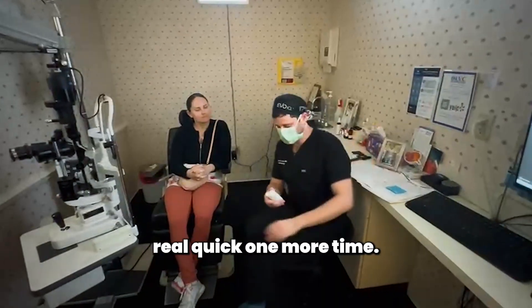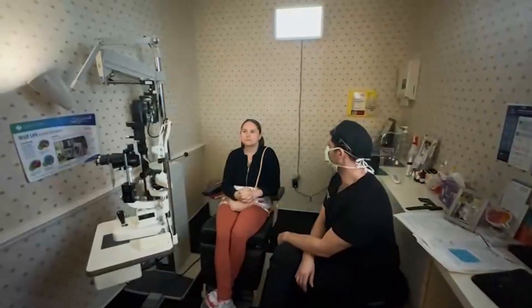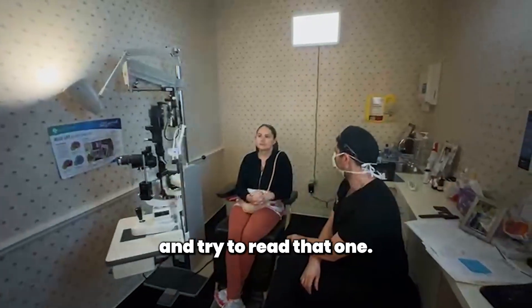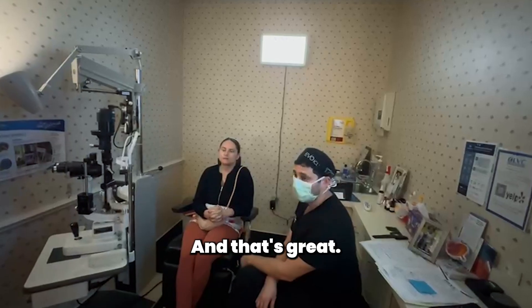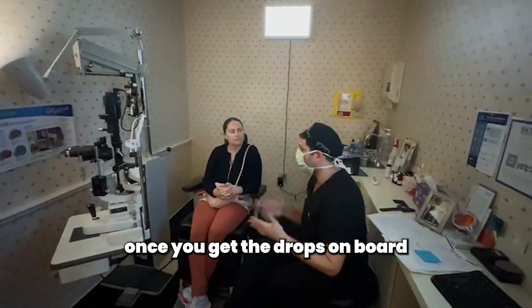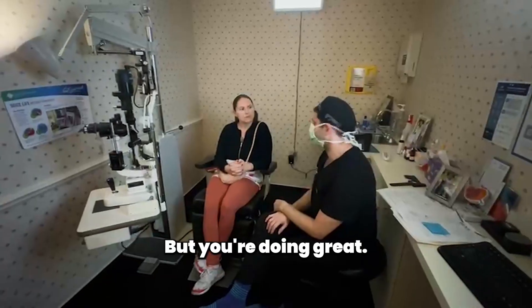Let's go ahead and check your vision real quick one more time. Up on the screen there, how much can you see? Go ahead and try to read that one. Perfect — that's 20-30, and that's great. So we're already 90% there. Hopefully tomorrow, once we get the drops on board and take the medicine for pressure, we're going to be doing great.